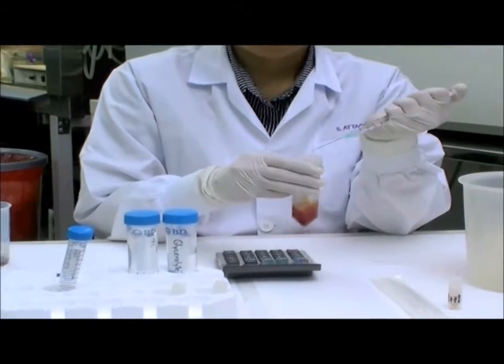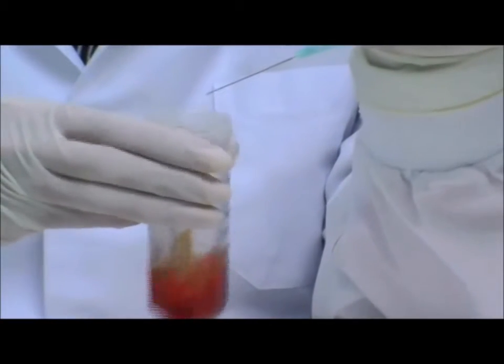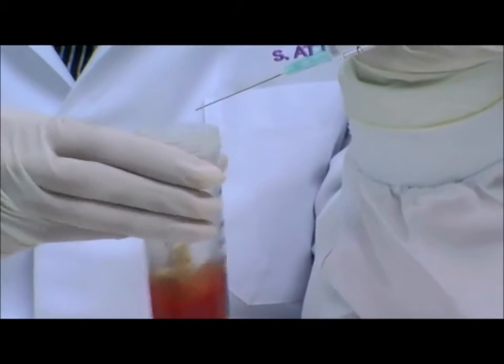Add the glycerolite to the packed red cells with continuous shaking. This part of the procedure must be performed slowly and should take 2 to 3 minutes.